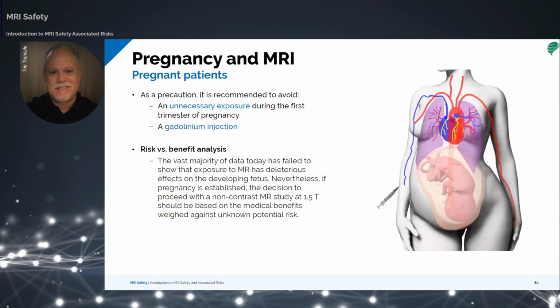In guidelines and recommendations for MR imaging safety and patient management, the Society of MRI writes, MR imaging may be used in pregnant women if other non-ionizing forms of diagnostic imaging are inadequate, or if the examination provides important information that would otherwise require exposure to ionizing radiation, such as fluoroscopy or CT. It is recommended that pregnant patients be informed that to date, there has been no indication that the use of clinical MR imaging during pregnancy has produced any deleterious effects.